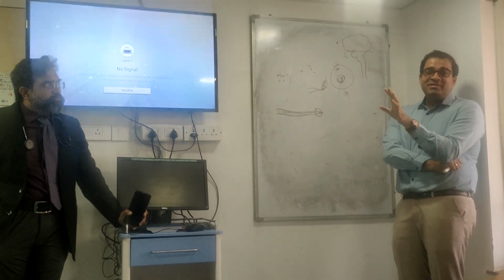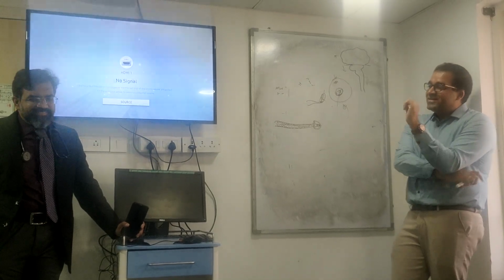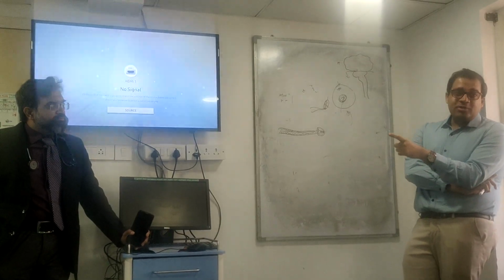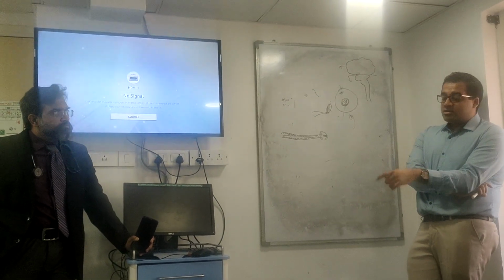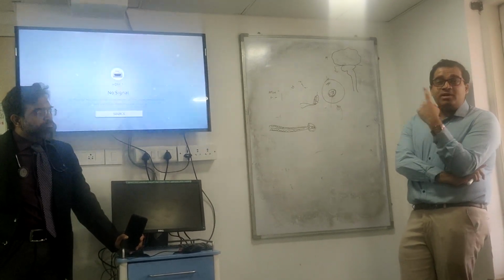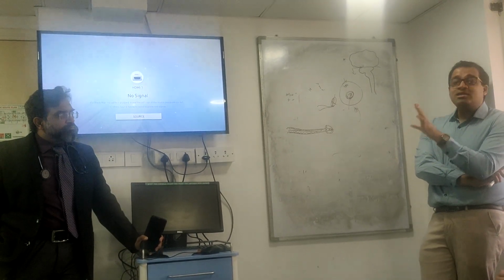If you have a liquid sample, you can inoculate it into this bottle. It's very ideal for pus samples, because pus will usually not grow in a pre-treated state, but in these bottles, which we've kept in the lab for 15 days, growth comes however much you pre-treat.